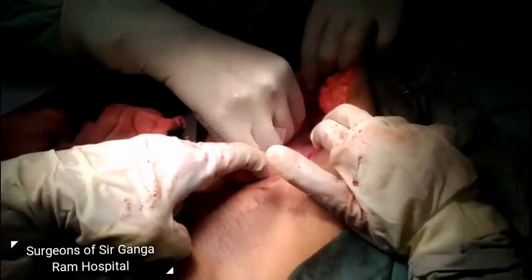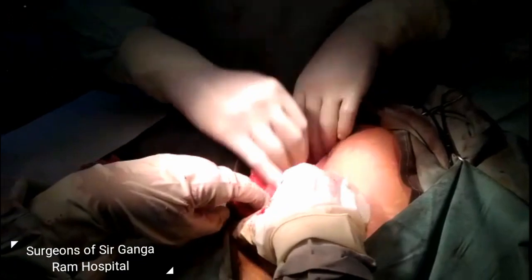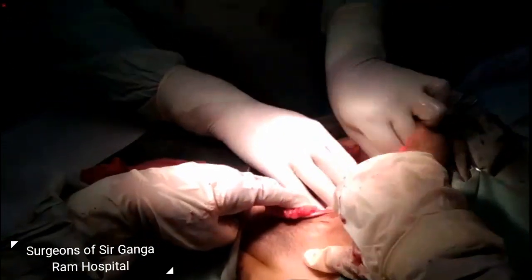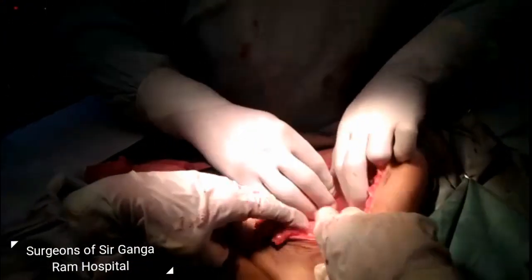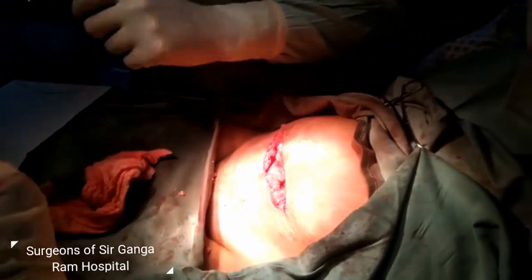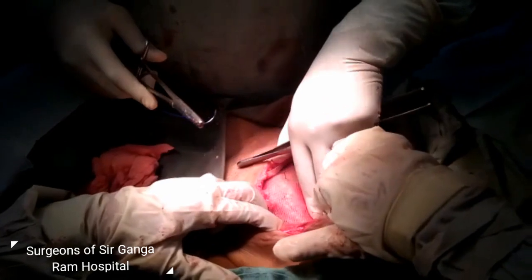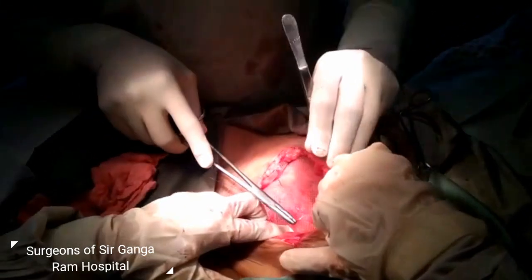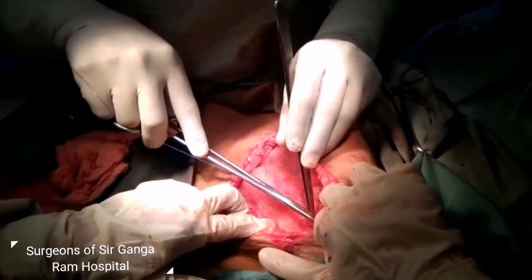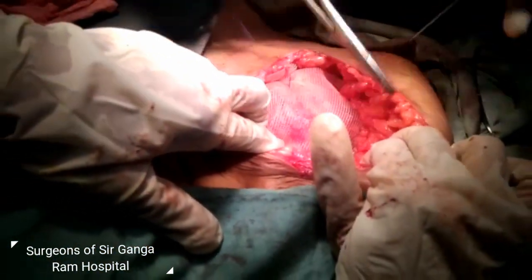We will use a medium-size mesh of 15 x 15 cm. We are placing a polypropylene mesh in this patient. The universal rule for mesh placement is that you must have 5 cm of dissection all around the defect, and the mesh should cover this area in order to prevent recurrence.